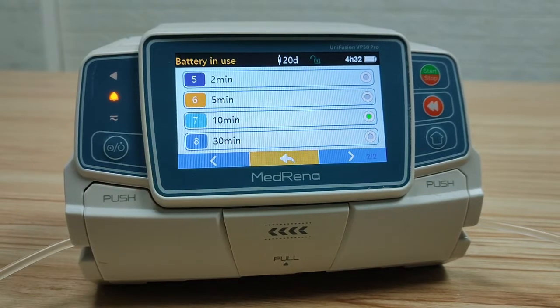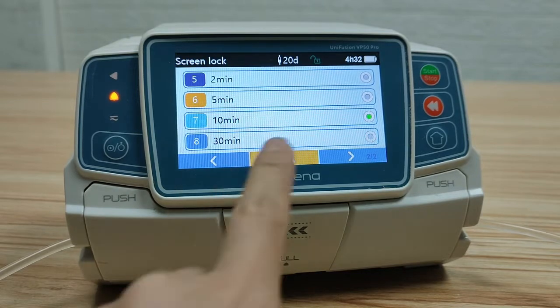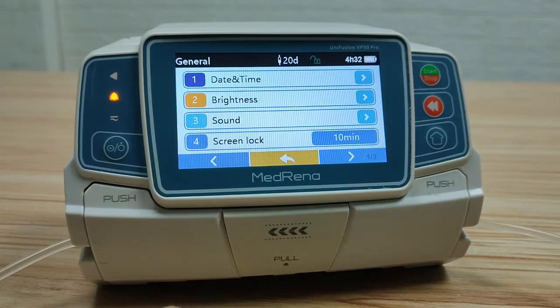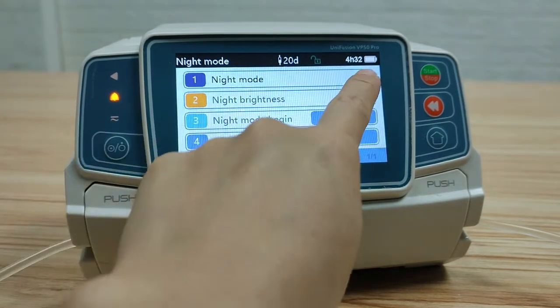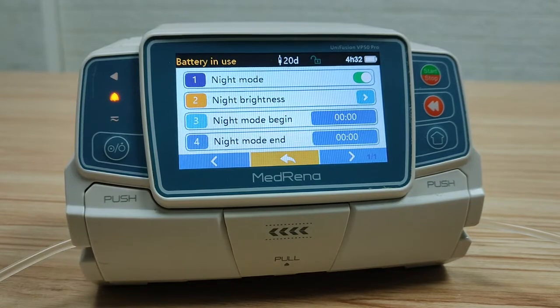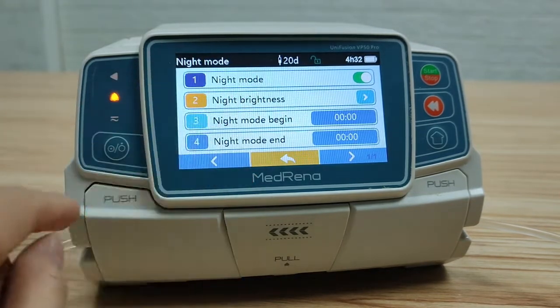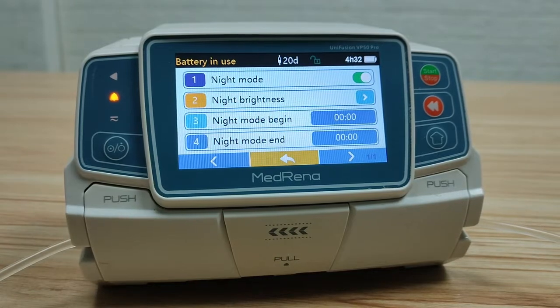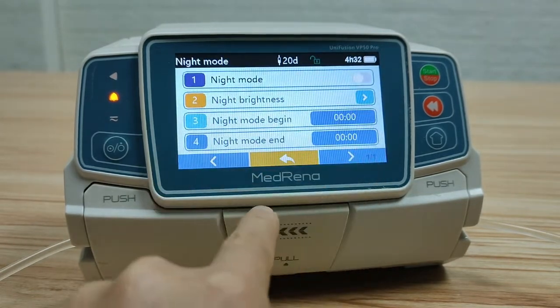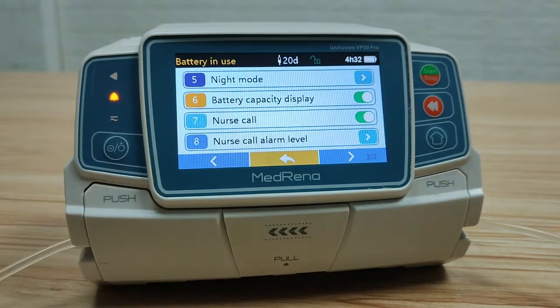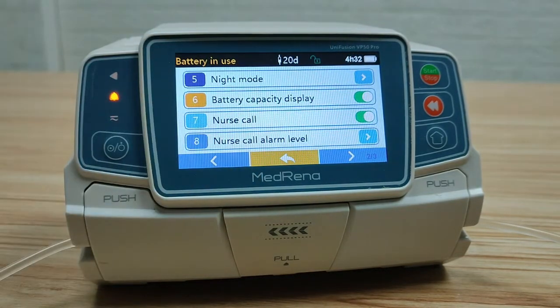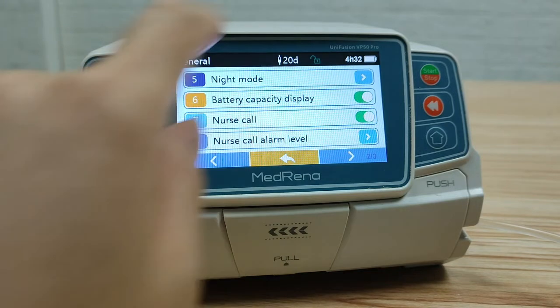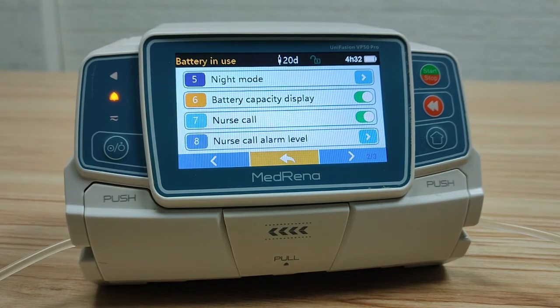Screen lock is to avoid intentional or improper operation. You can select night mode on or off; if on, choose the night brightness and the time for the night mode. Battery capacity display: select it on and the screen title bar will show the remaining time that the pump can operate based on the current battery power supply.